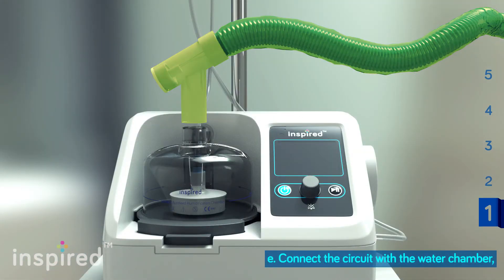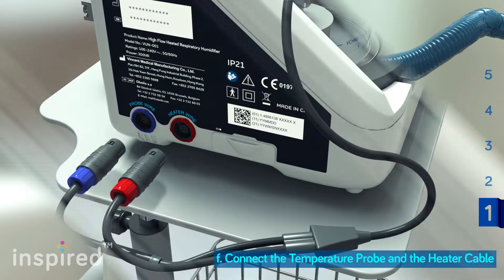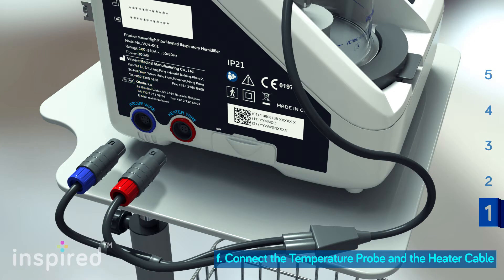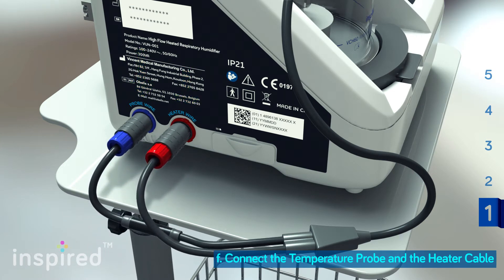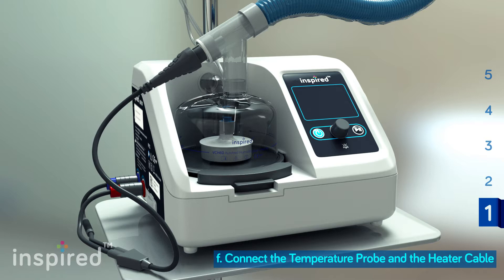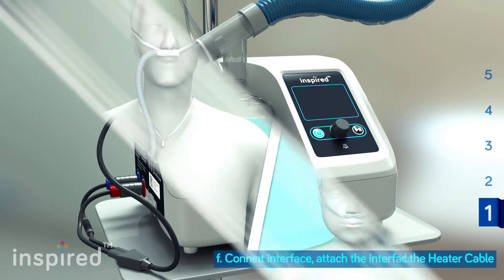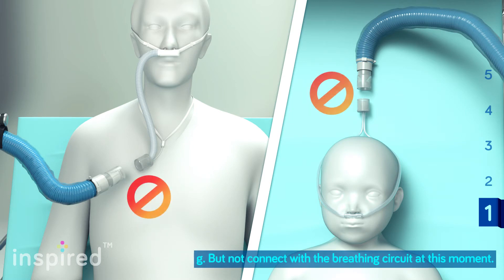Connect the integrated heated breathing circuit to the chamber. Secure the connecting cables at the respective ports with the correct colors on the device. Attach the six-pin connector on the other end of the connecting cable to the breathing circuit. Select and attach the correct patient interface onto the patient. Do not connect the breathing circuit at this moment.